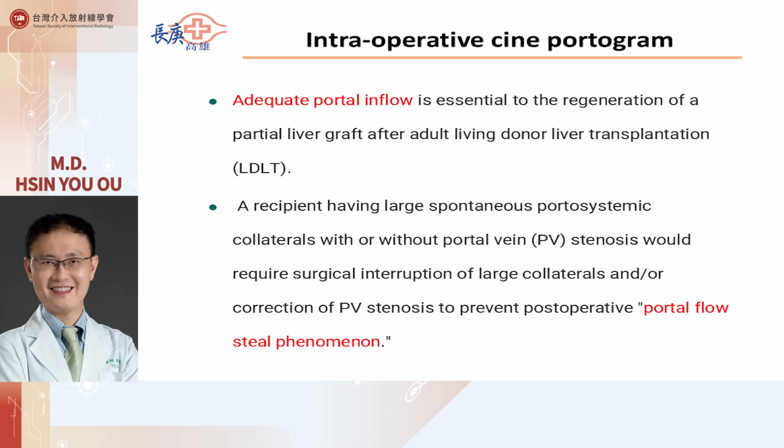But insufficient portal flow may induce portal vein thrombosis, and large collateral veins can cause the portal vein steal phenomenon, and then maybe too slow portal inflow. So today we want to make sure of adequate portal inflow, so we will do the intraoperative portal gram.